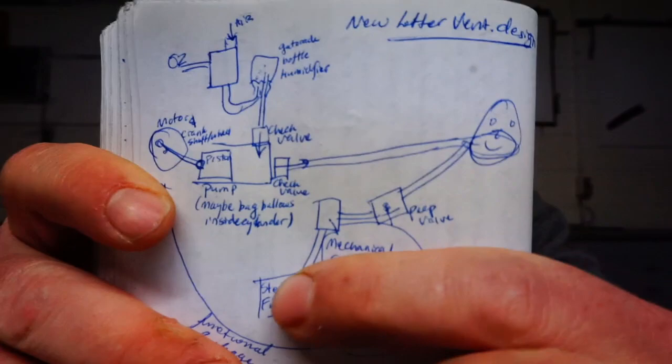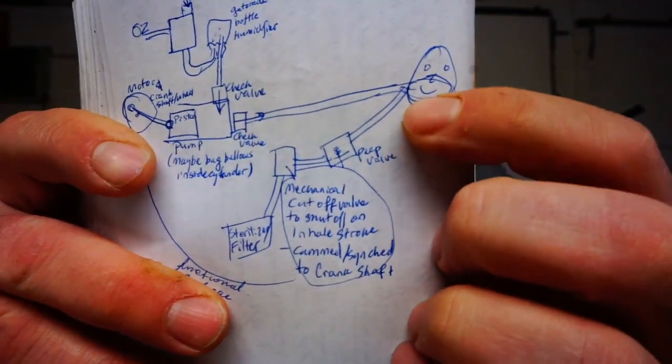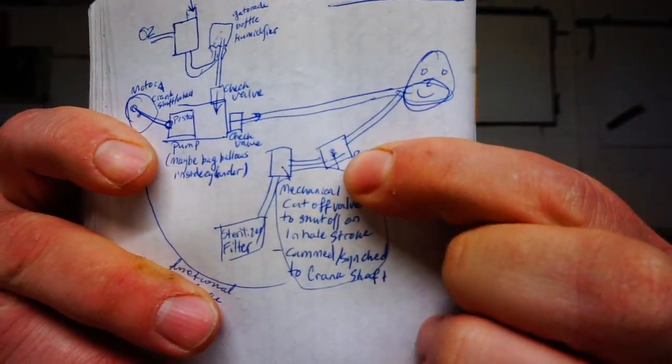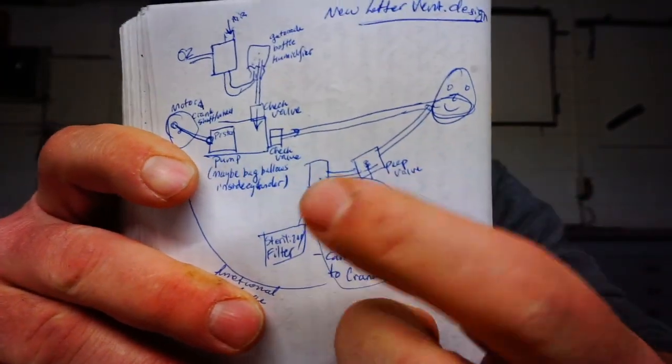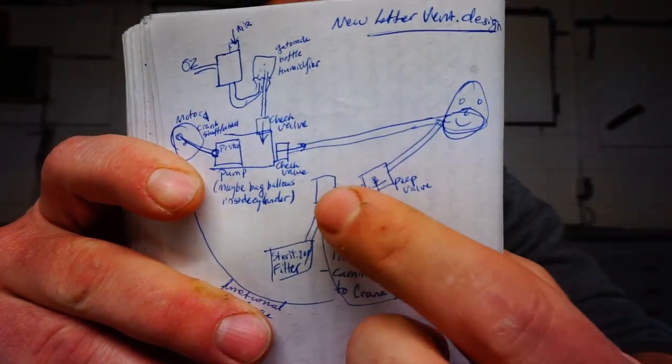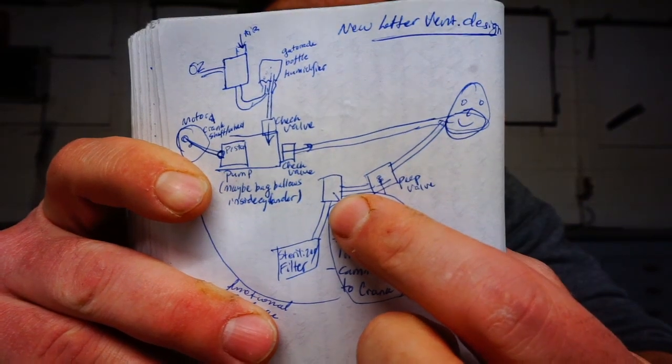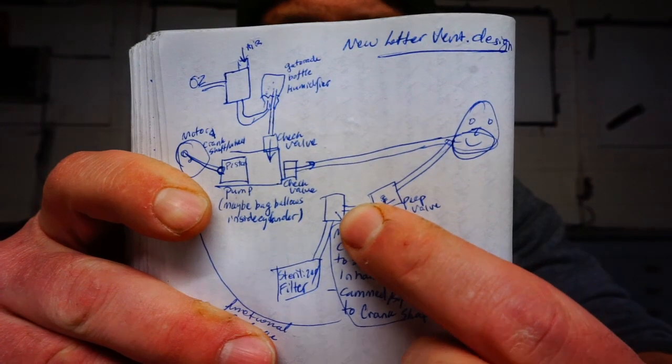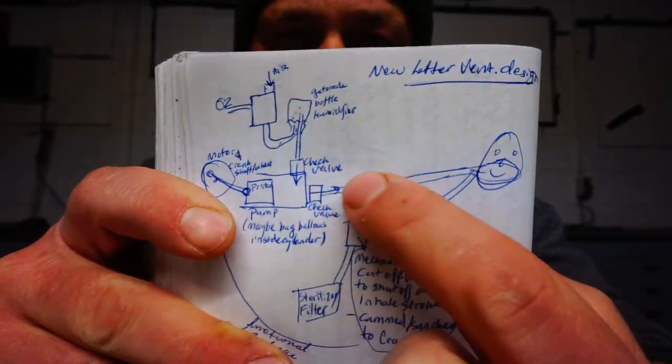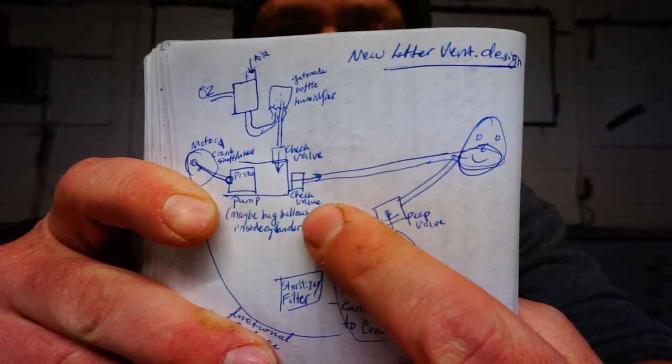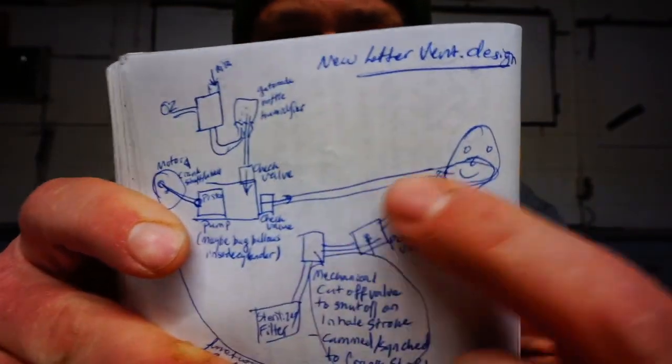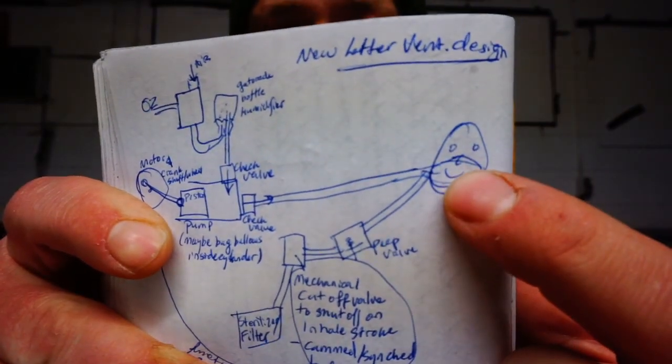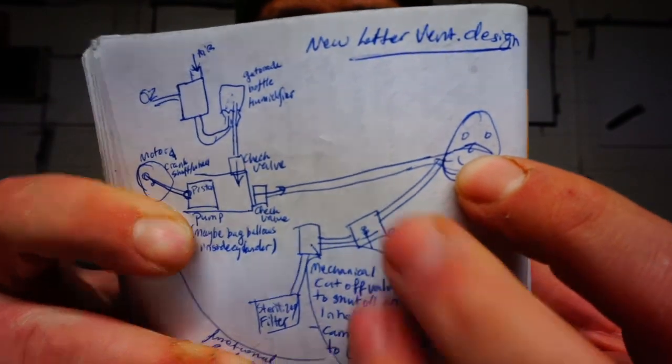Then you have this PEEP valve, which is this guy that I designed, which is a valve that will exhaust up to a certain pressure, and then at a certain low pressure it will cut off. And then after that you have a manually activated valve that will cut off this entire circuit during the inhale phase. So while this piston is pushing air into the patient, this valve closes, blocking the PEEP exhaust, forcing air into this patient.